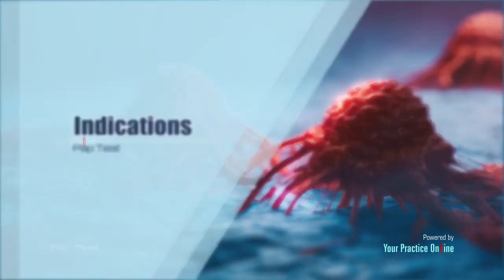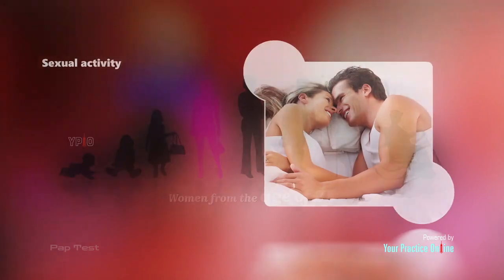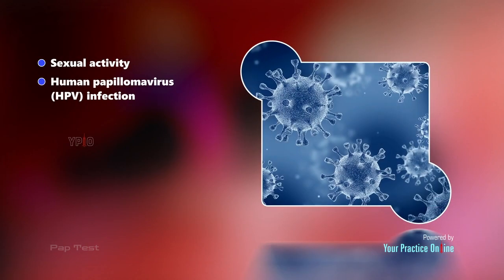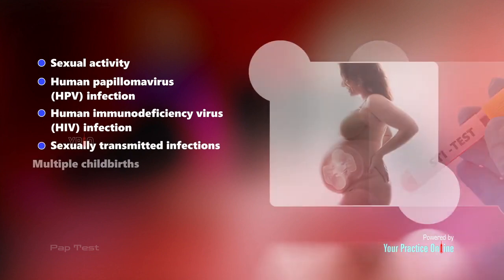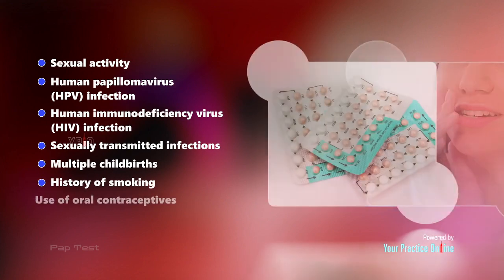Indications. A Pap test may be recommended for screening for cervical cancer in women from the age of 21 every 1 to 3 years depending on the results of the last Pap test, and the risk factors for cervical cancer, which include sexual activity, human papillomavirus (HPV) infection, human immunodeficiency virus (HIV) infection, sexually transmitted infections, multiple childbirths, history of smoking, use of oral contraceptives.